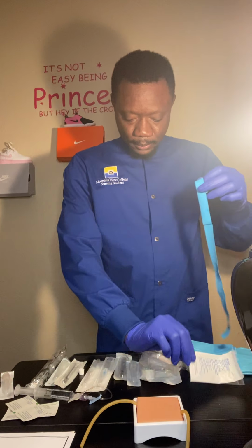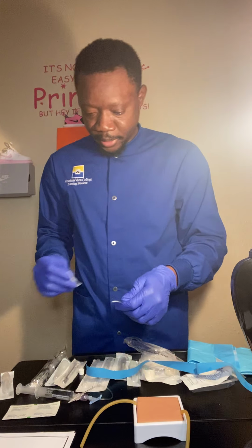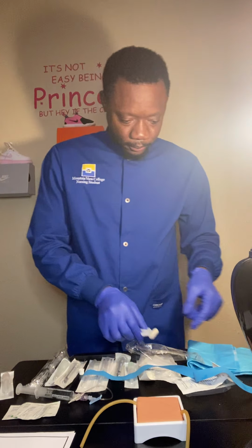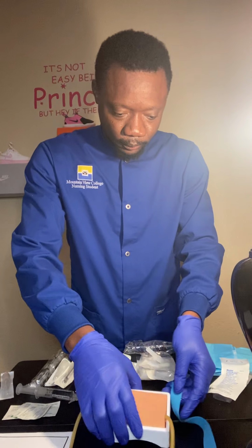I should go ahead and get my tourniquet. So before then, I'll get my alcohol prep ready. Okay, I can use this one. So I get my tourniquet. This is my patient's arm, okay?